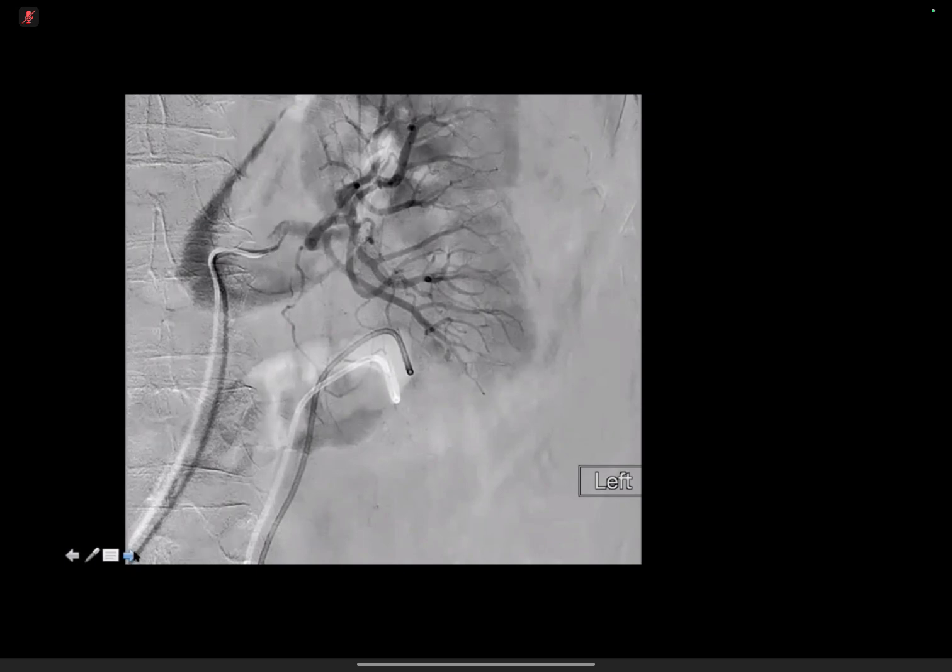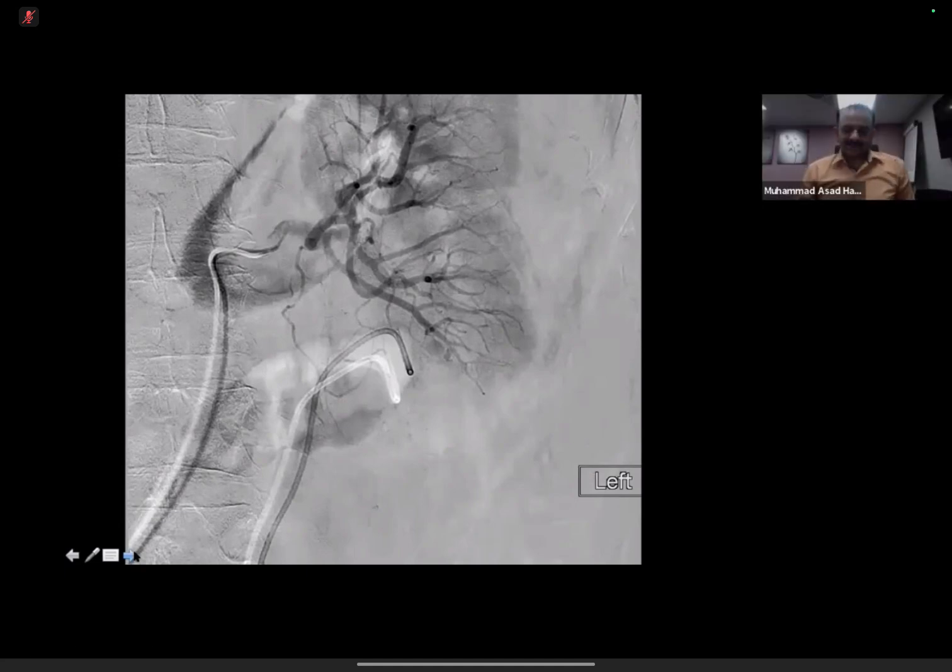So regarding the angiogram, I can see a small pseudoaneurysm in the lower renal pole. Brilliant. Again, you nailed it. Very well done. Okay. So for other candidates, this is the abnormality. This is a small pseudoaneurysm. This is a patient who has had a PCNL procedure performed. Following the procedure, he was having continuous hematuria, and as you can see, there is a small pseudoaneurysm.